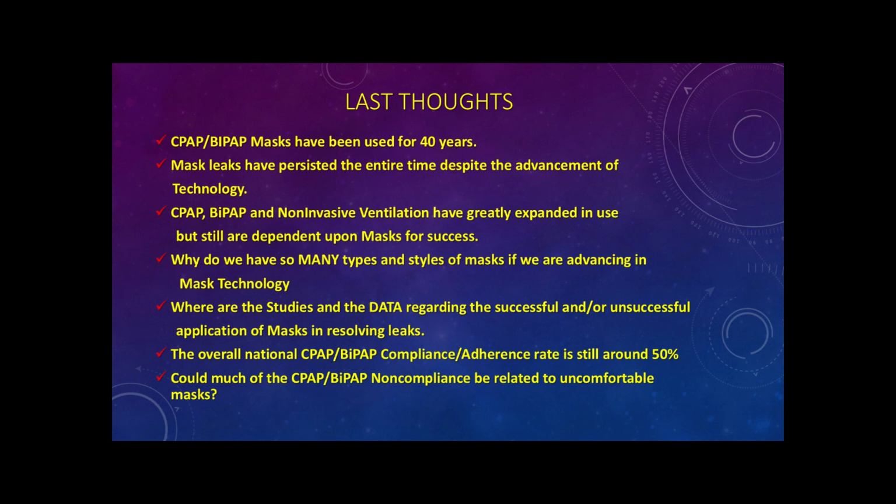The overall national CPAP BiPAP compliance adherence rate is still around 50%, kind of similar to our finding of patients newly set up who wanted to get a new mask. Could much of the CPAP and BiPAP noncompliance be related to uncomfortable masks? The thing is that we have technology, we now have a little bit more knowledge, but it still is a human factor in terms of how we treat the patient, how well we do the mask assessment, how well we do the mask fitting, how well we follow up with the patients, but mostly how can we coach the patient to get over a lot of these inconveniences.